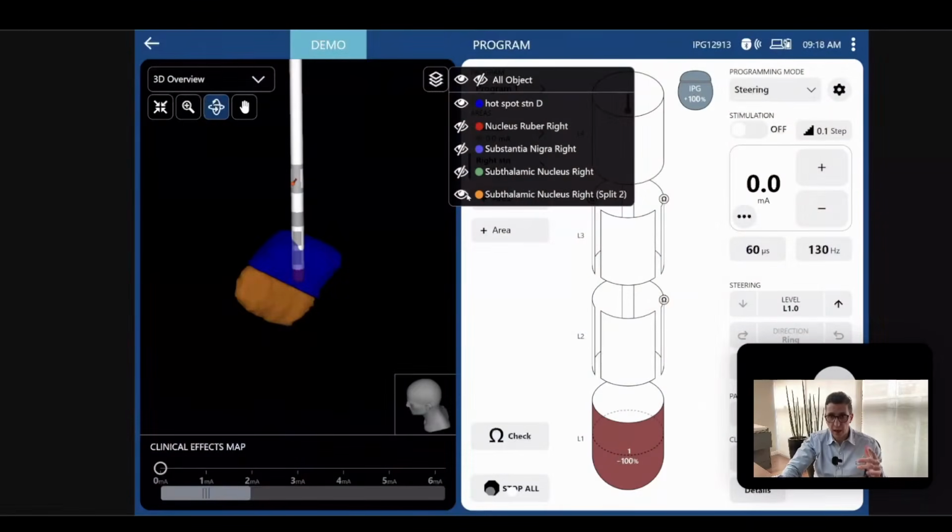So look here. If you haven't seen the other class, please go back to the class where I teach you how you cut, and then you're going to understand right here. For example, this is a screen of the software to program my patient, and look how beautiful. Here I have the electrode.